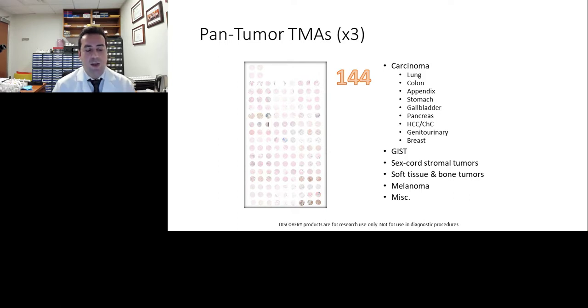This application allowed us to have a broad view of the distribution of PD-L1 and PD-1 expression and the immune response in different types of tumors.